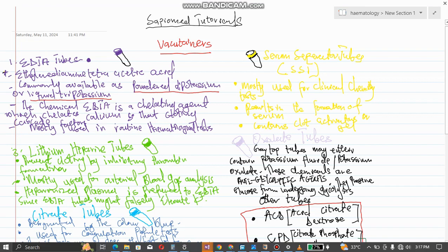In our previous video, we talked about an introduction to hematology, and we discussed the various components that we have in blood and their respective functions as well. Today we'll be talking about vacutainers as used in the clinical laboratory setting or in hematological setting.